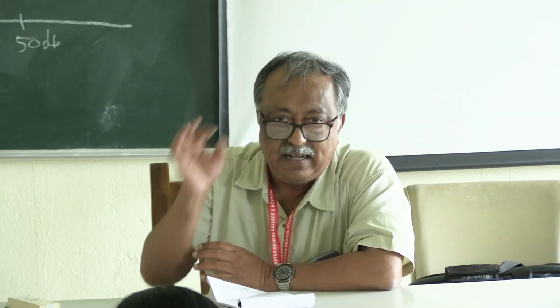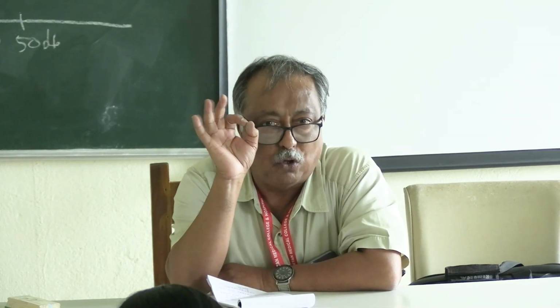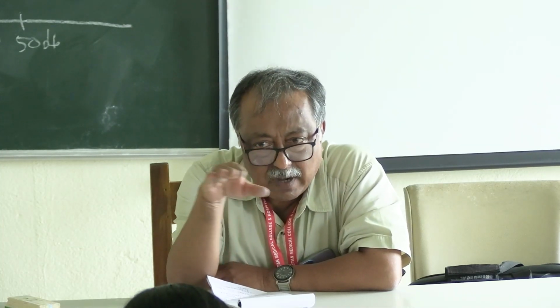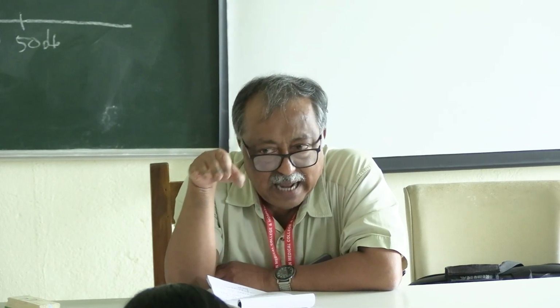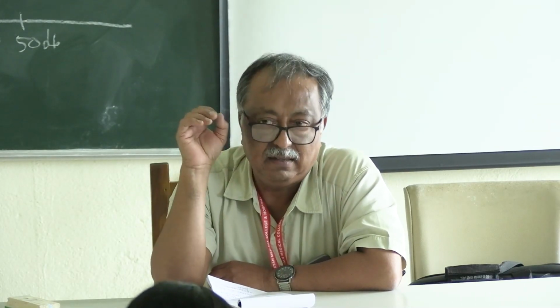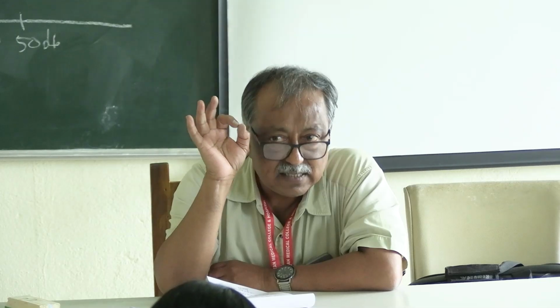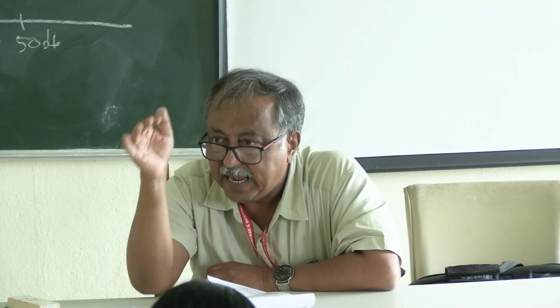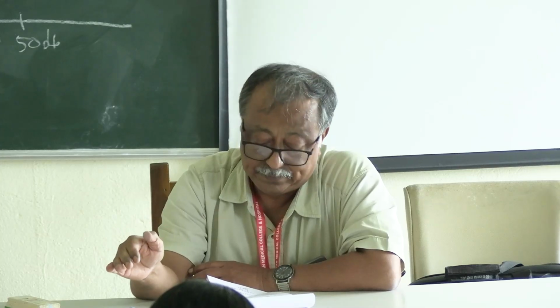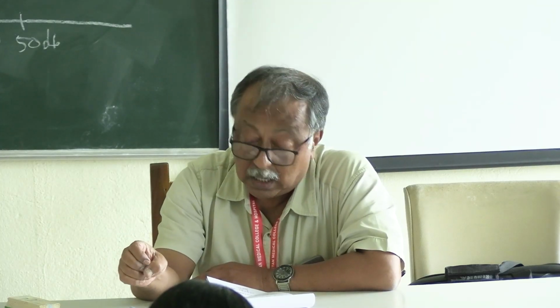Lastly, it is the Carhart tone decay. It is typical for a neural pathology. If you give a continuous beep, after a certain time, gradually that will decay. It is a characteristic of any neural pathology. If you give a stimulation, it will decay after some time. It is the nerve fatigability.